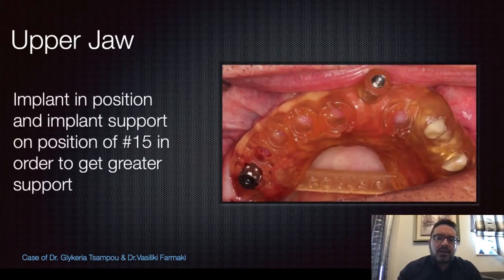Here we have another support after placing the implant in position 15 with the anchor kit of the Megagen implant system. You can add extra support to the surgical guide by fitting the metallic pin into the implant, which gives you better stability without using a lot of pins.